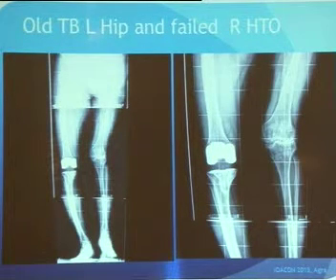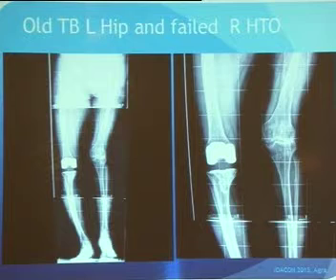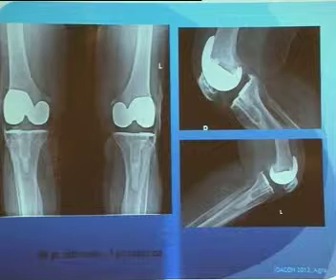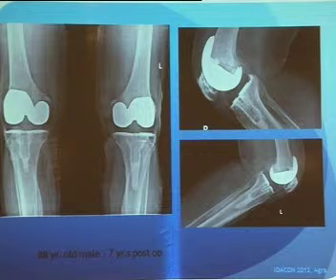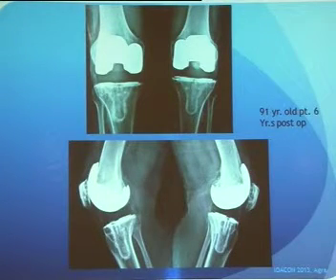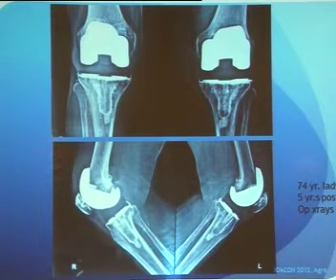A 69-year-old lady had a failed high tibial osteotomy on one side and a failed hip because of an old tuberculous hip on the other side. So she had all poly on one side. Another 88-year-old gentleman, 7 years post-op x-rays. A 91-year-old gentleman, 6 years post-op. A 74-year-old lady, 5 years post-op x-rays.